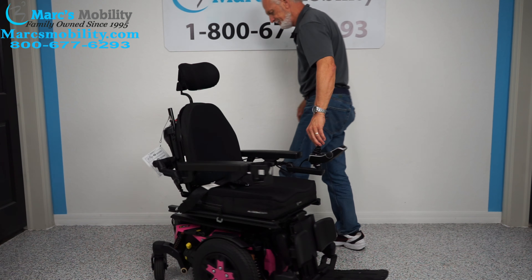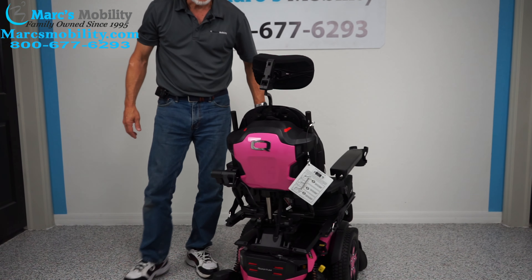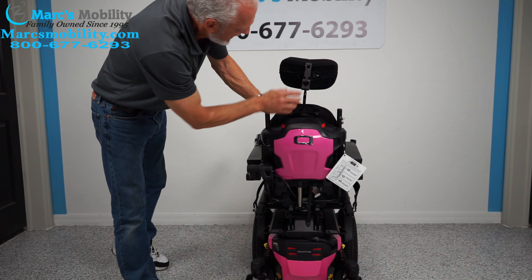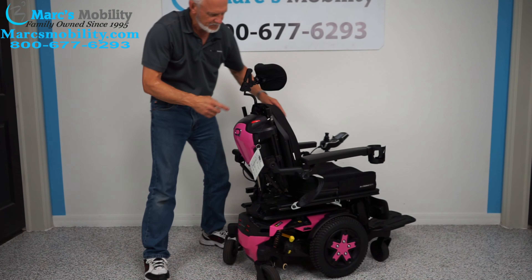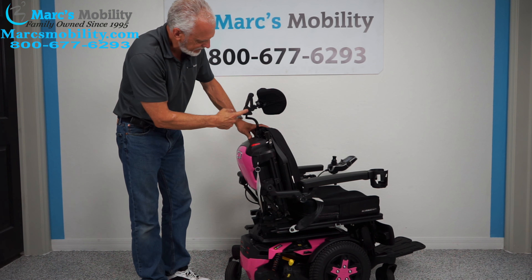The back of the chair — it's a gorgeous power chair, you can see how well built it is. The headrest is fully adjustable, with all kinds of adjustments that can be done.